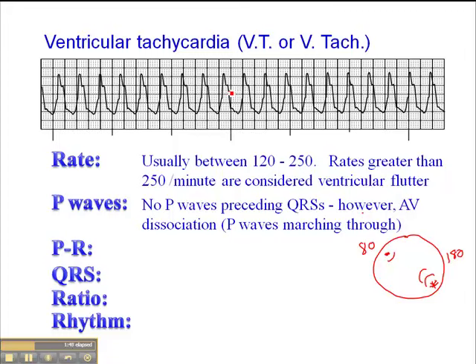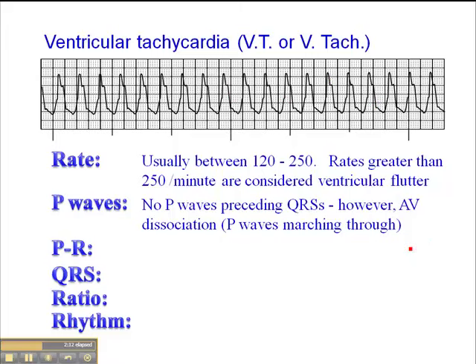If you saw a notch — evidence of a P-wave here, one here, and one over here — where these P-waves appeared equidistant and disassociated from the QRSs, that would support and be diagnostic of VTAC. In the other 50% of VTACs, there's a focus in the ventricle that depolarizes both the ventricle and the atria, so we don't see evidence of P-waves.